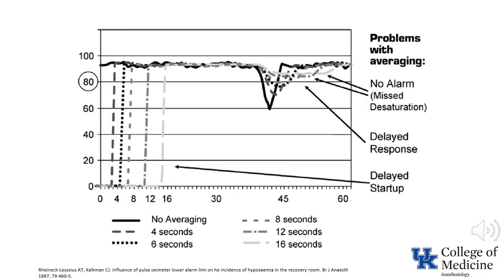This study reports the results of pulse oximetry alarms for post-op patients in the PACU. The default averaging was 3 seconds. Using a computer-generated assessment, when averaging was extended to 10 seconds, false alarms were reduced by 50%. If the data were averaged over 42 seconds, the alarm rate was reduced by an additional 82%, but almost 10% of the episodes of hypoxemia would not have been detected.